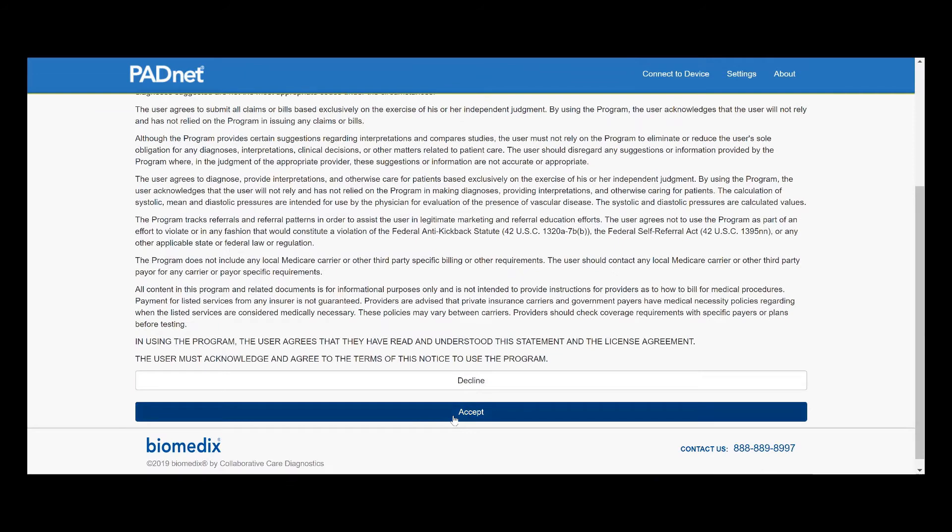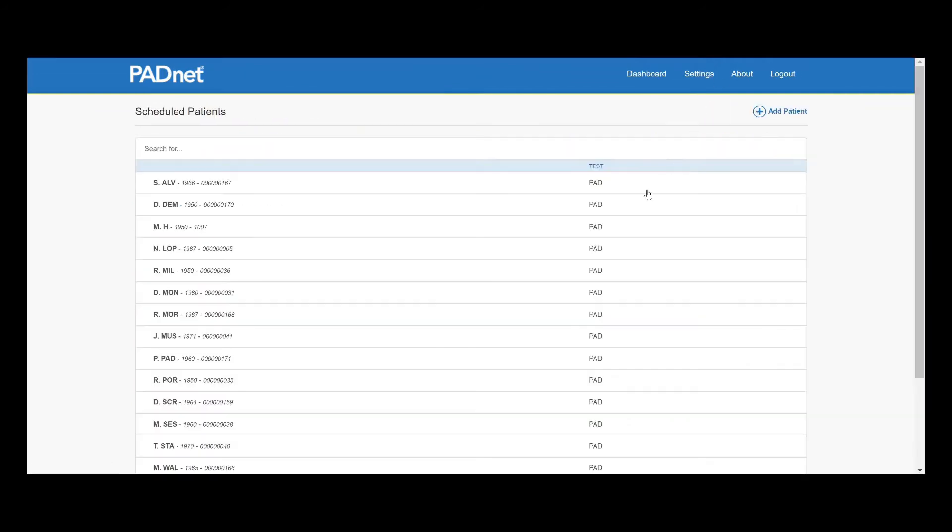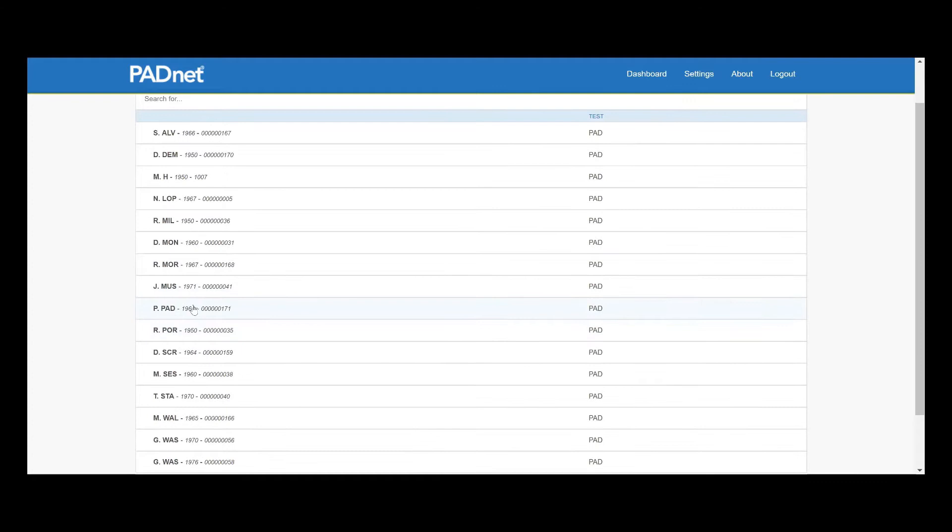Once we accept our terms, we'll go into our scheduled patients tab and find our patient PadNet PadNet. They'll be notated by their first initial, the first three letters of their last name, their year of birth, their PIN number, and the type of test.